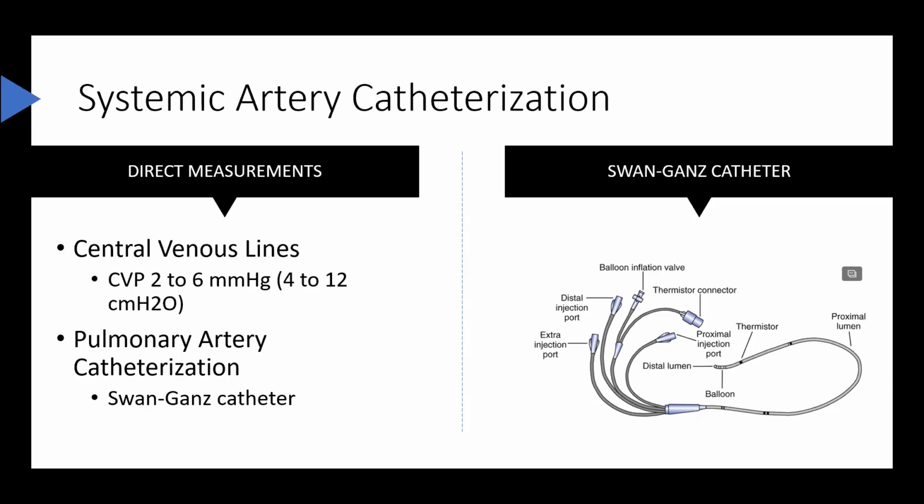Bleeding can occur if the line becomes disconnected or is improperly handled. Hemorrhage is a distinct possibility if the line is left open. Therefore, the clinician should stabilize the catheterized site by taping the patient's arm to a board and placing it above the bed linen for easy observation.